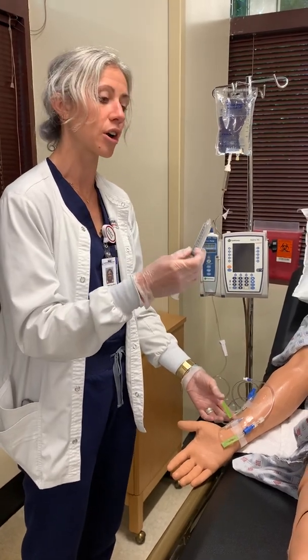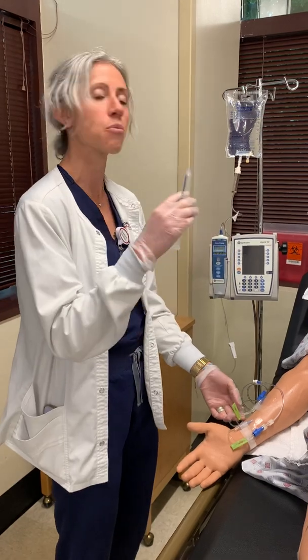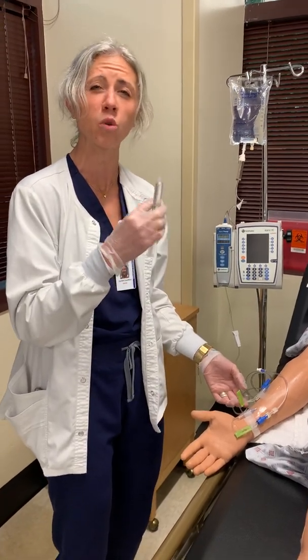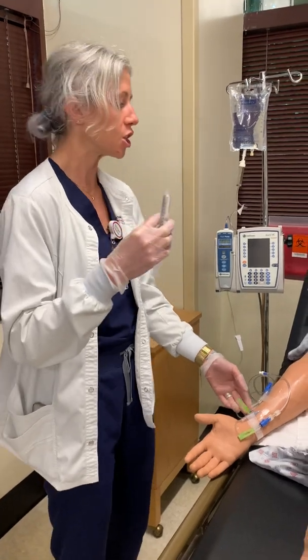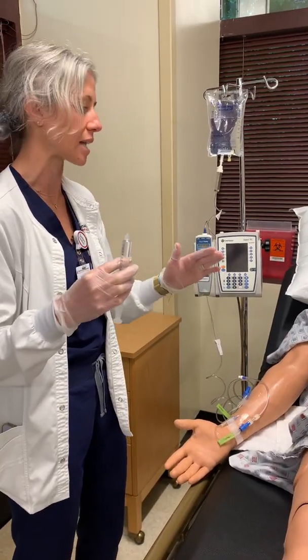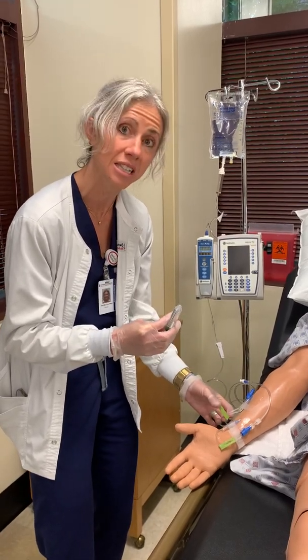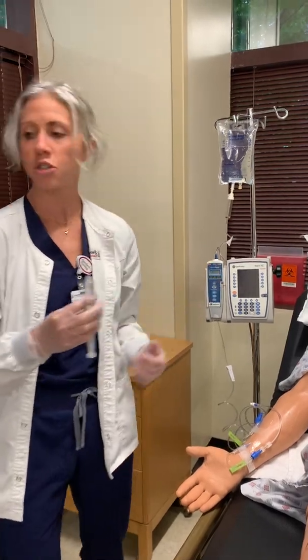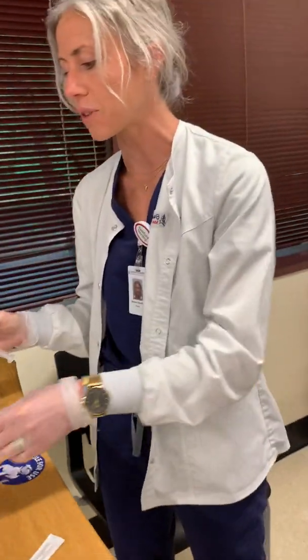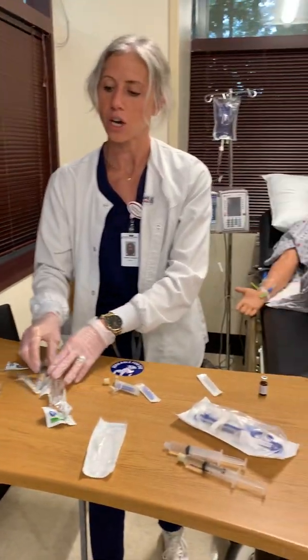And then in the same regard, now I have a whole lot more fluid to work with. So I can talk to my patient, but I have more fluid to work with. It makes it a whole lot easier when you're pushing a small volume drug like that. After that, everything would be the exact same. Once again, if I did use my saline lock, I'm making sure this is nice and locked before I leave. Looks good. So now my patient has safely gotten his morphine. Once again, I'm going to dispose of all of my things as we've done.